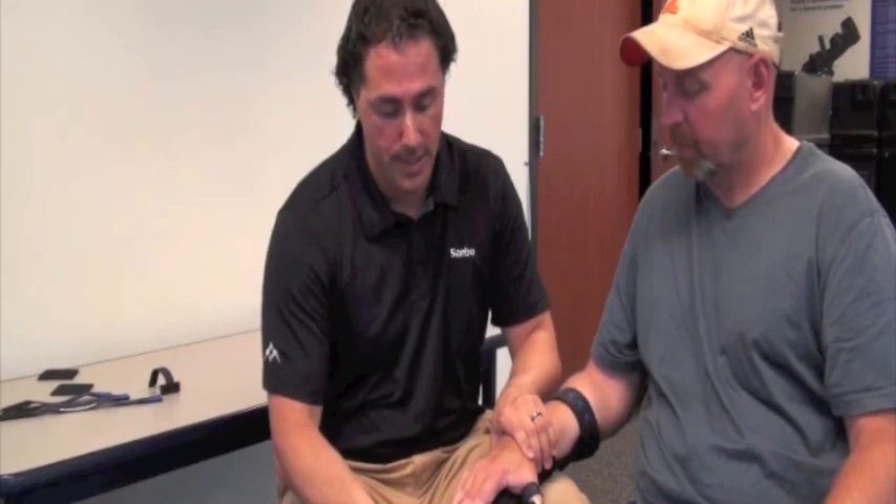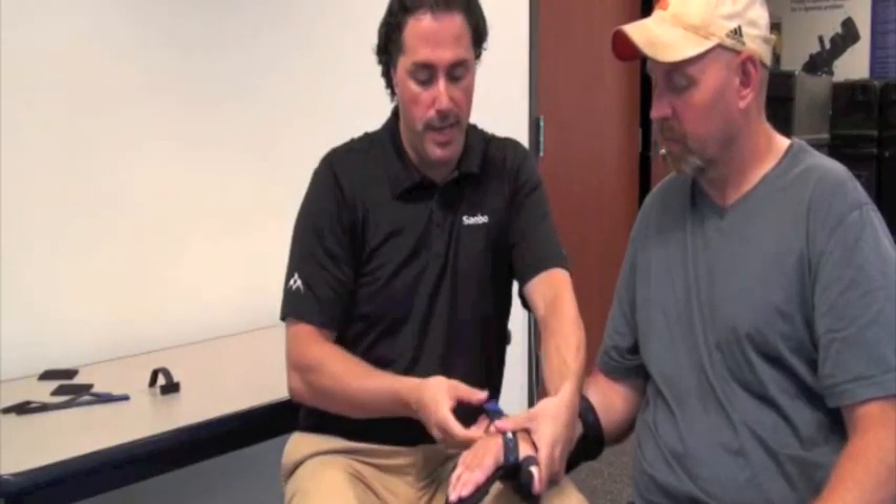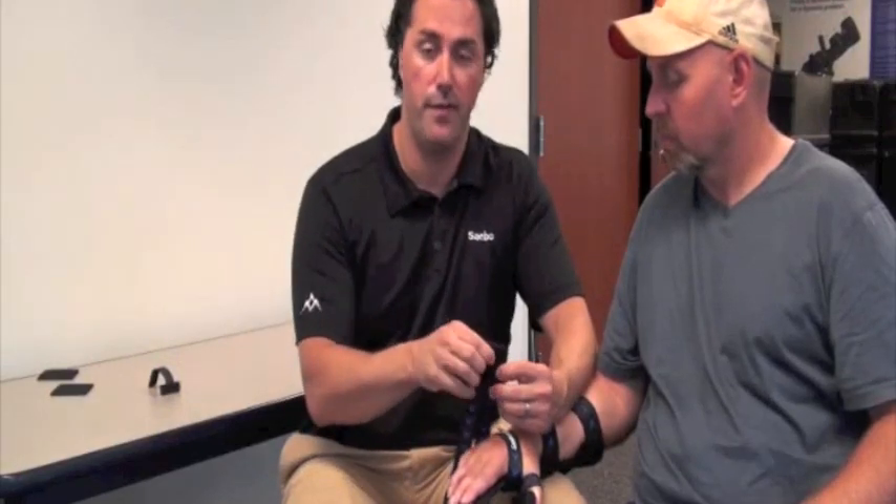The next step is to apply the hand strap. Attach it to the volar side of the splint, come up and around, and that will stabilize the hand so you can finish with the finger straps and the fifth digit strap. There are two finger straps — you can use just one if the patient has mild tone. If they have more moderate tone, feel free to use both straps.